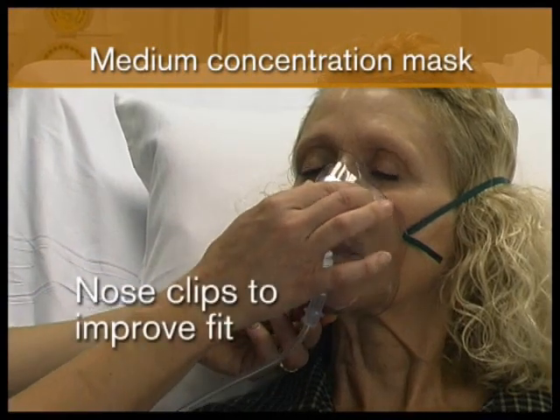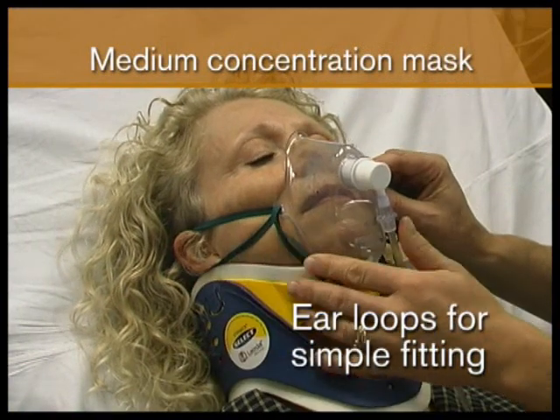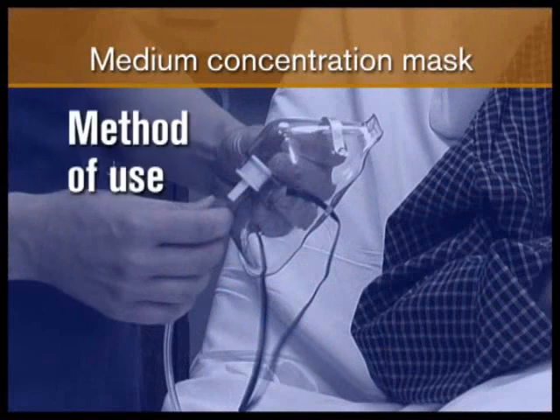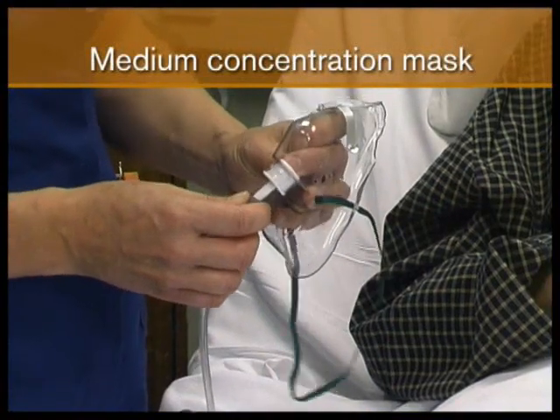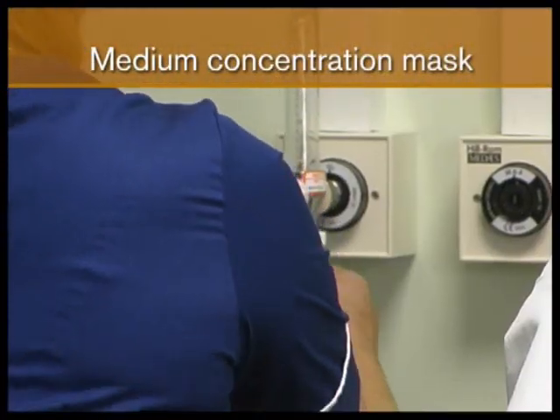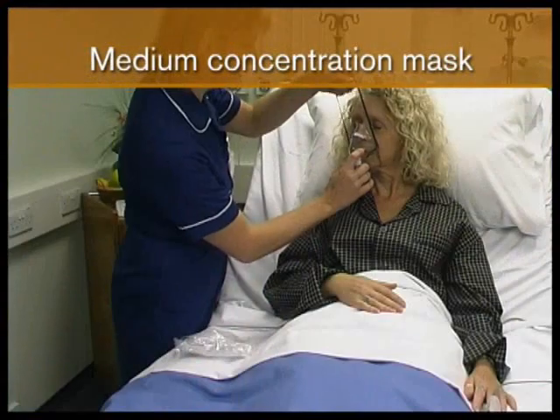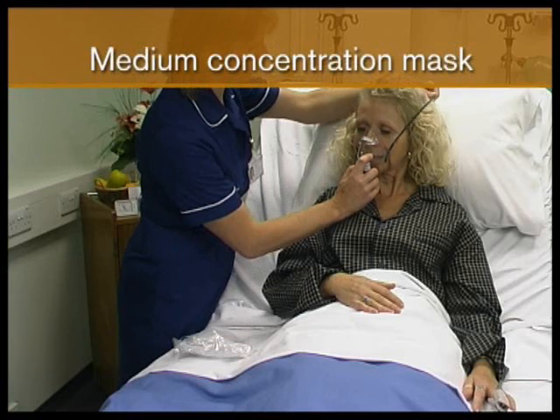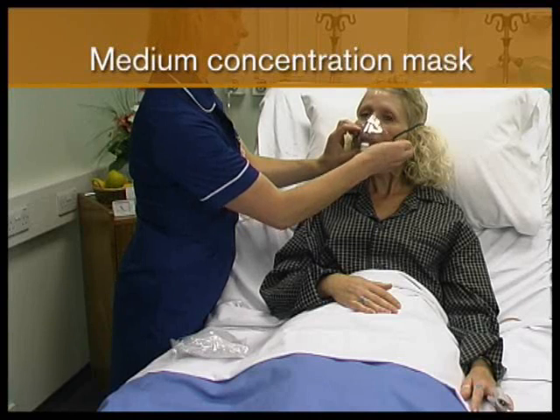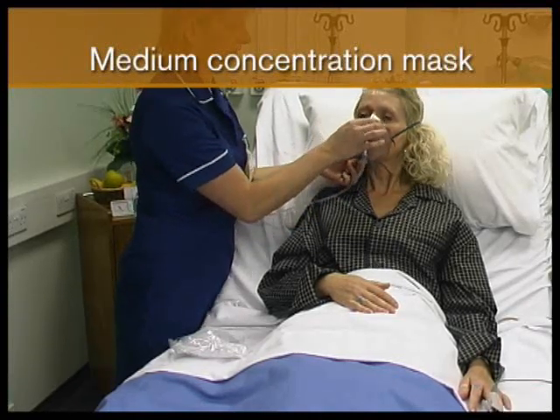Some masks have nose clips to improve the mask fit. Designs are available with ear loops, which make it unnecessary to lift the patient's head when fitting. One end of the oxygen tube is attached to the spigot on the mask and the other to the oxygen flow meter. The flow meter is set to give the prescribed oxygen concentration. The mask is then fitted over the patient's nose and mouth, and the elastic tightened to give a secure, comfortable fit. If the mask has a nose clip, it is pinched to provide the best possible fit.